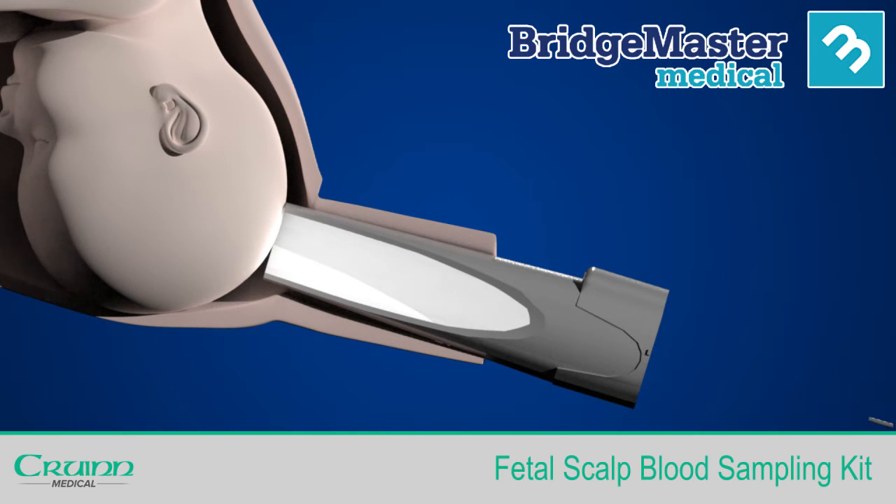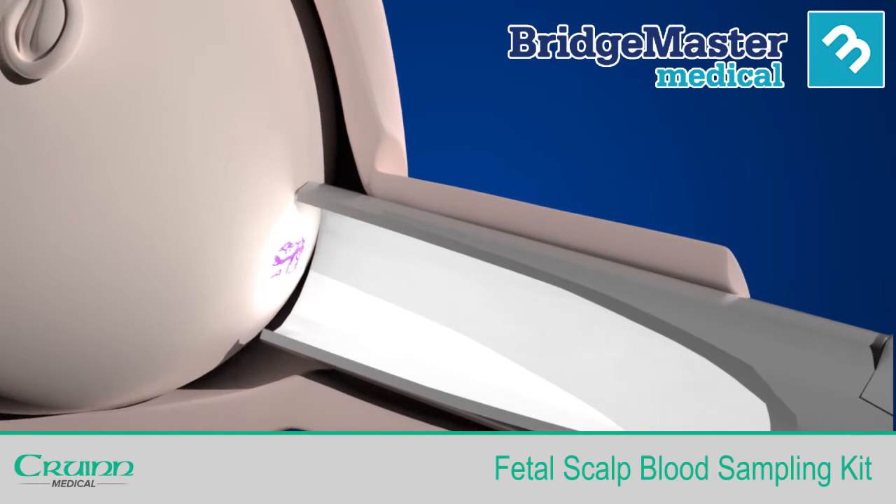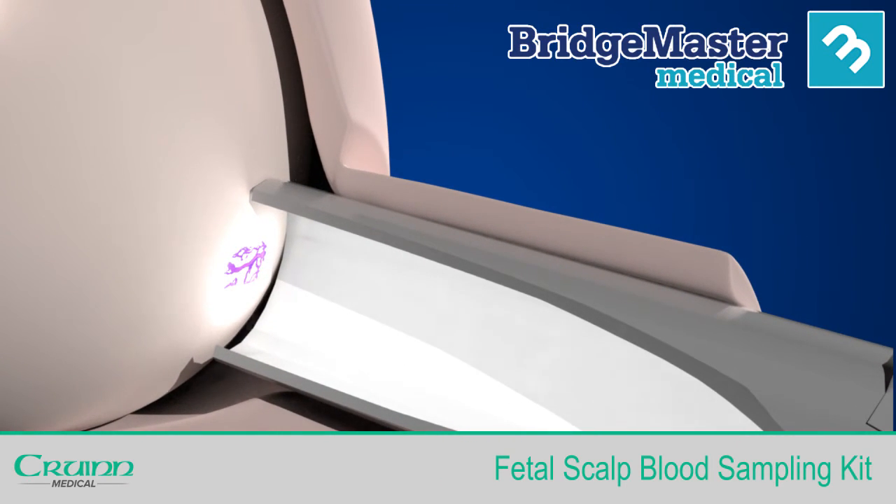Now spray ethyl chloride directly onto the fetal head to promote capillary action and to numb the scalp. Alternatively, you may use another suitable anaesthetic spray.